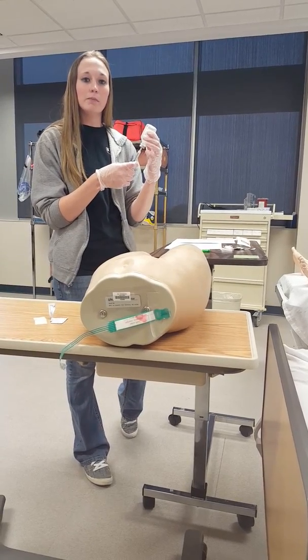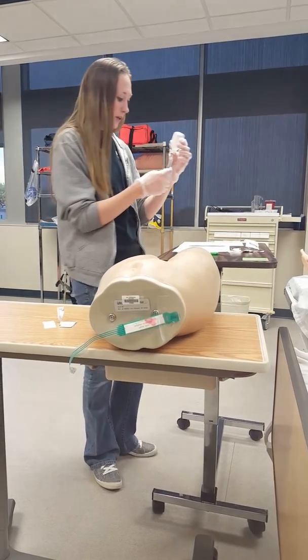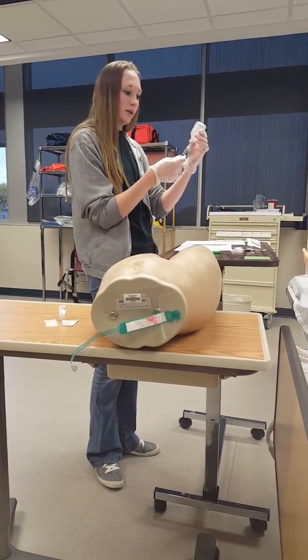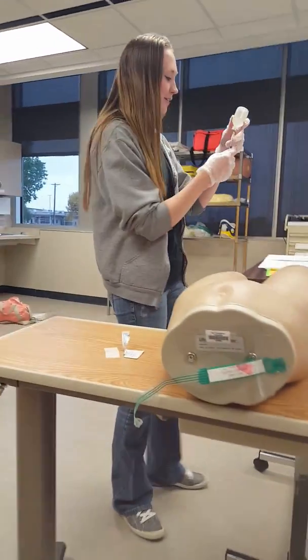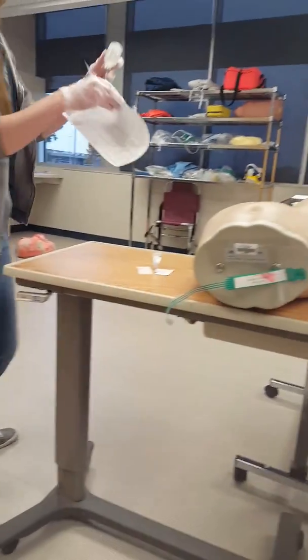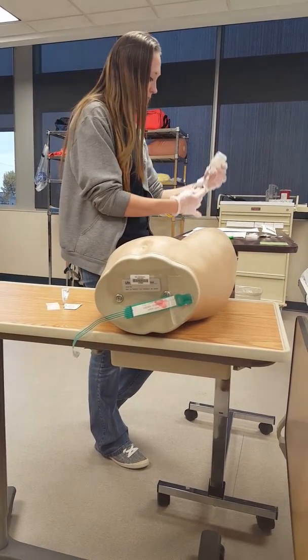And then I'm going to cite my 5 rights. So right patient, right med, right route, right time, and right dosage. Okay, and then I'm going to do my 3rd check. I have my 2nd check, and then I'm going to do Demerol, 2 mLs, and I'm checking my vial, and then to my MAR, Demerol, 2 mLs. And then I would ask my person, so if she could look at this for me. Okay, check your MAR, and then check your syringe. Good. All right. And I'm just going to check it one more time. So I do Demerol, 2 mLs, Demerol, 2 mLs.